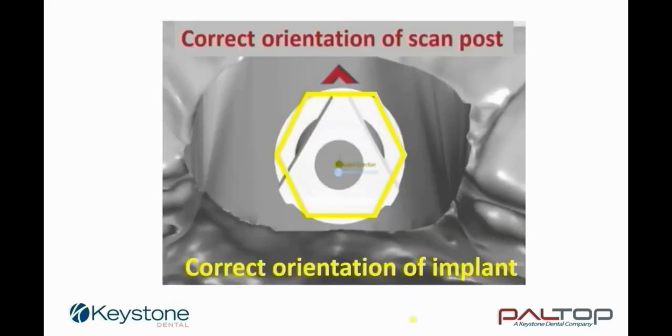Please note that in order to achieve the desired result of angulating the screw access channel from the buccal to the palatal aspect, it is essential to ensure the correct orientation of both the implant and the scan body. The flat of the implant must point to the buccal aspect. The point of the scan body must point to the buccal aspect.